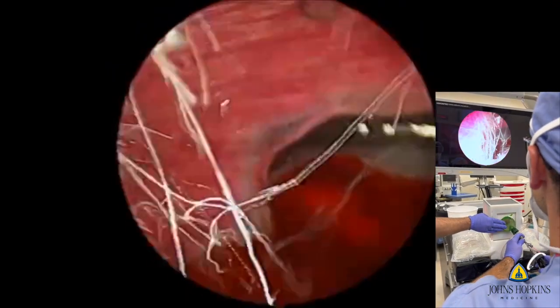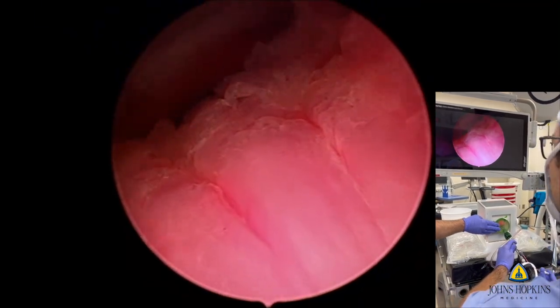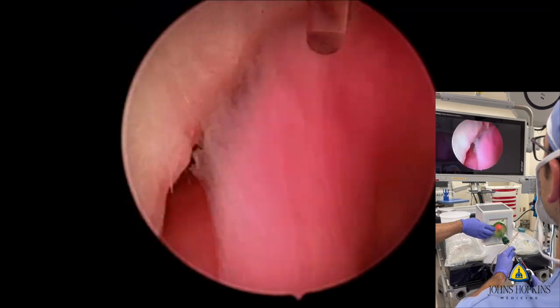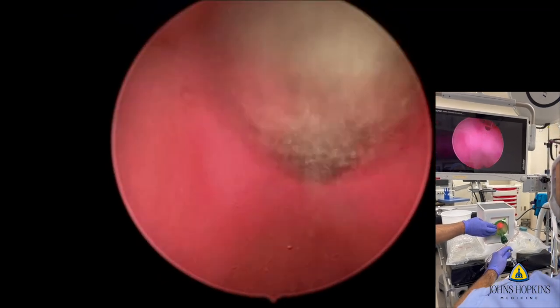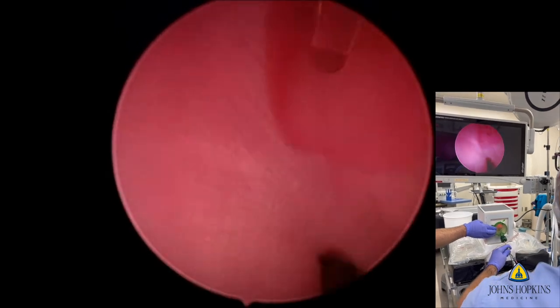We've seen cases where trainees have gone really sub-trigonal and missed that quite significantly. You can see from the outside view that the surgeon is truly manipulating the endoscope as they would in a real procedure to enable them to get the entire adenoma in block.